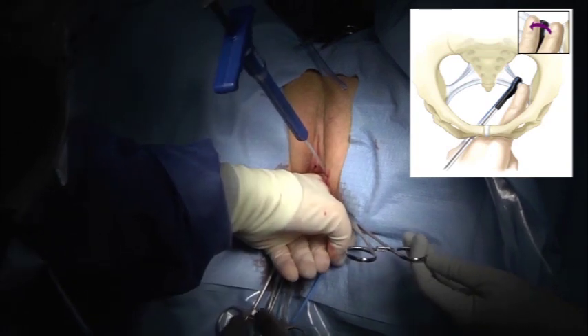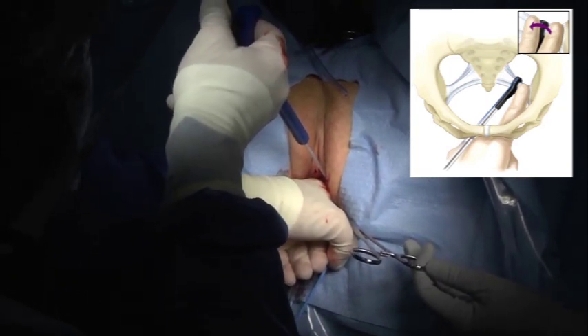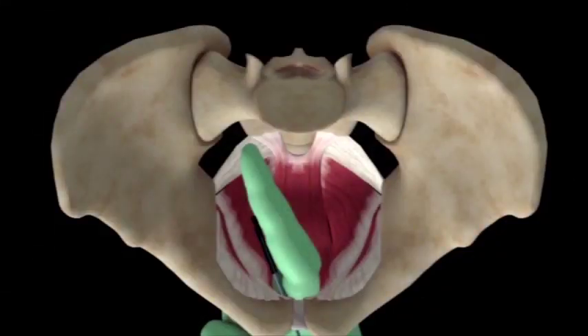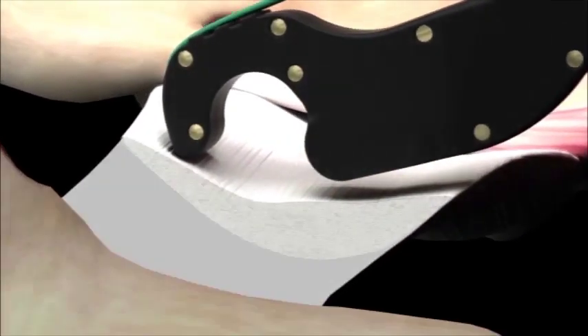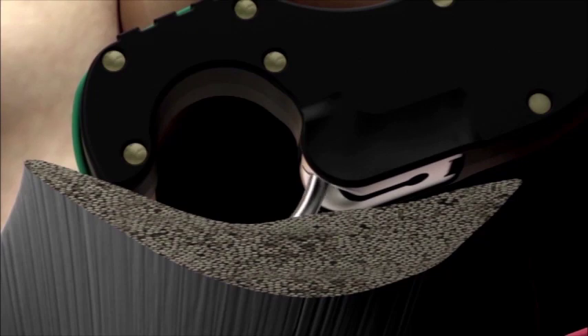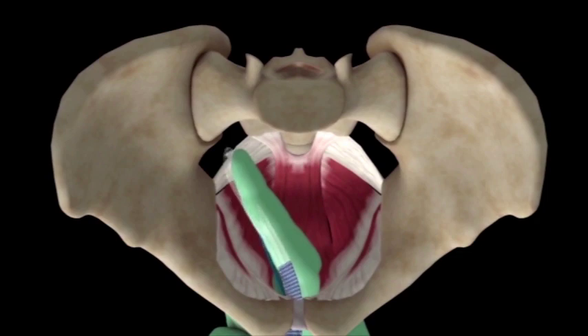Once securely positioned, I depress the capio driver button with my right thumb until it is fully depressed. Release, and if needed, pull the driver button back to allow the carrier to retract into the housing. This will drive the dart through the ligament and into the catch of the capio device. Withdraw the capio device, bringing the mesh assembly along.